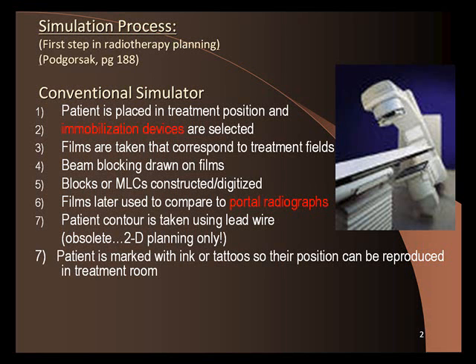And then we digitize that into our treatment planning computer, and then we put the beams on, and the computer just had that one contour, but it was able to calculate the doses in that one contour. That's called 2D treatment planning. Okay. So that's really old. It's important for you guys to know it, the background, but we don't do that anymore.